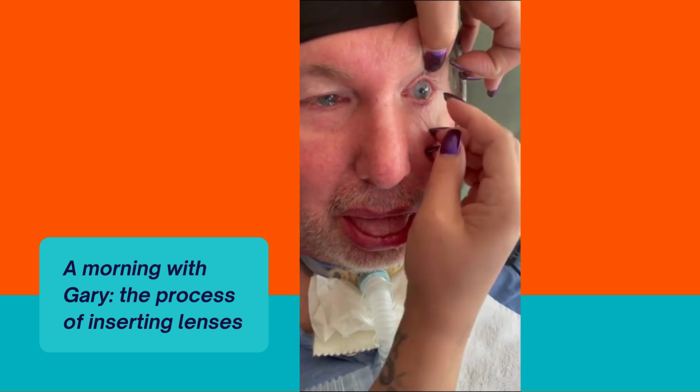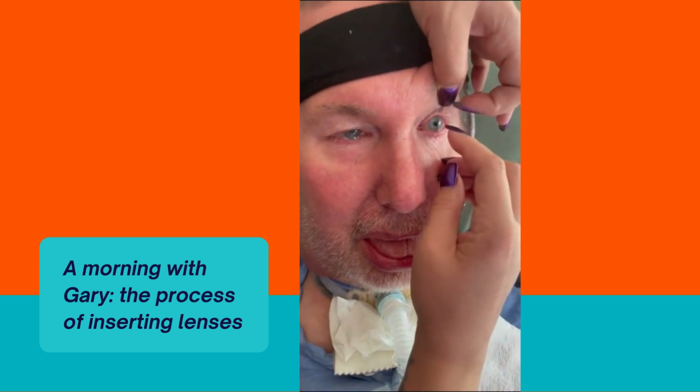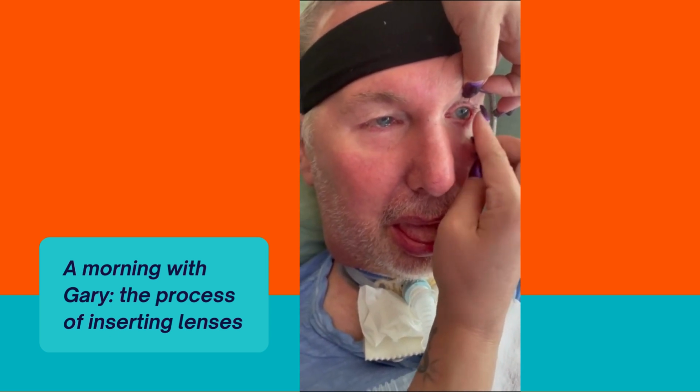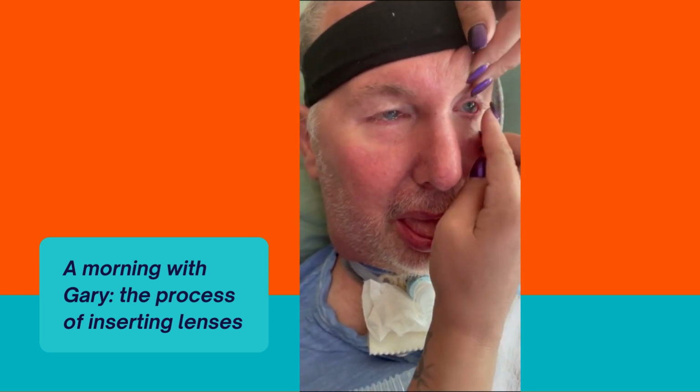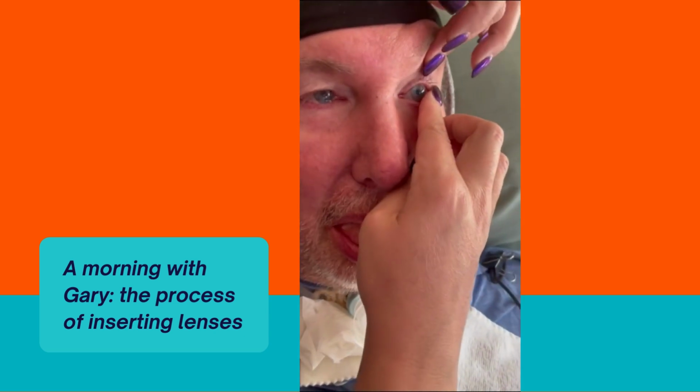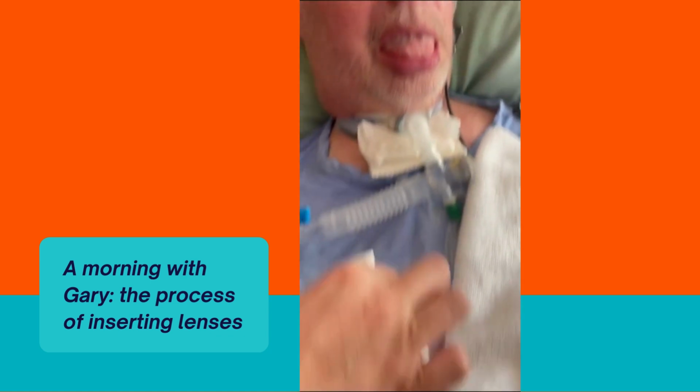His dots are right here at the top of his iris. If they're not, you can spin them. This is a little tricky part, but let's turn this way so they can see the dots clearly. It's a little harder in the left eye. How about we do it with the right eye?